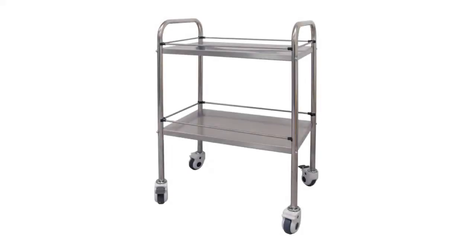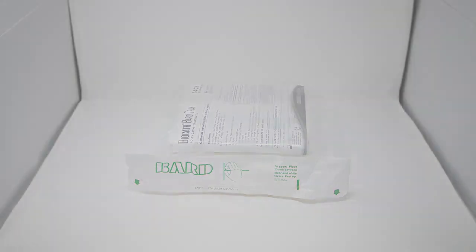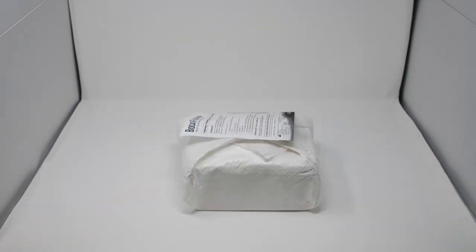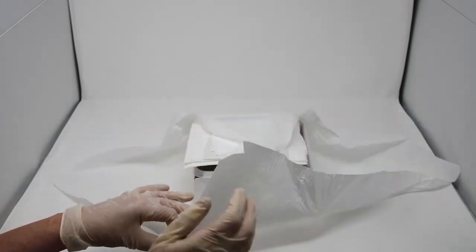Using a sterile procedure trolley or, in a community setting, a clean, secure working surface, open the BARD tray using the thumb guides to ensure that the inner sterile field is not touched. Slide the inner sterile contents onto the sterile preparation field. The first items in the tray are the disposal bag and apron.